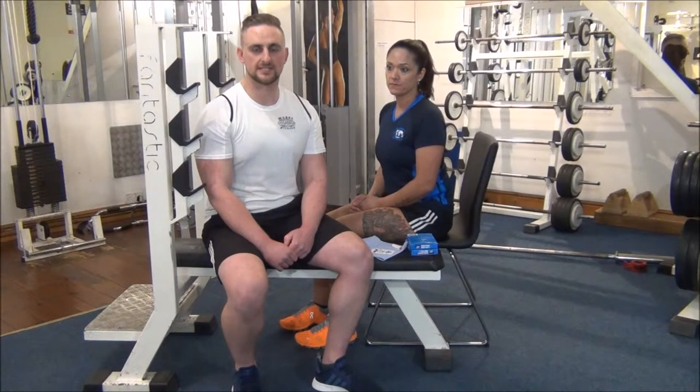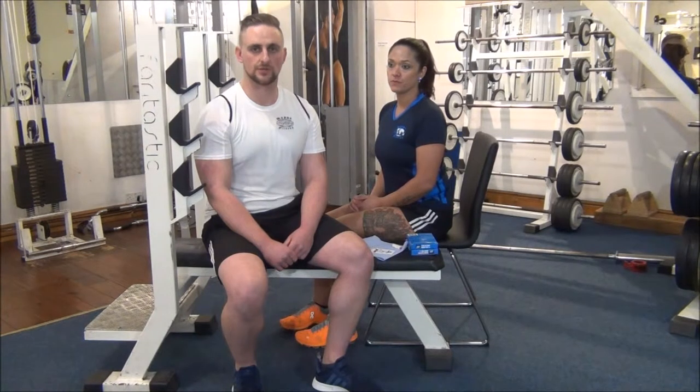The next static test we're doing today is a cholesterol test. Most gyms and trainers have got access to this by getting one of their home kits from a local chemist on the high street. We've actually asked Jess to fast for 12 hours before we do this test to give a nice accurate result.